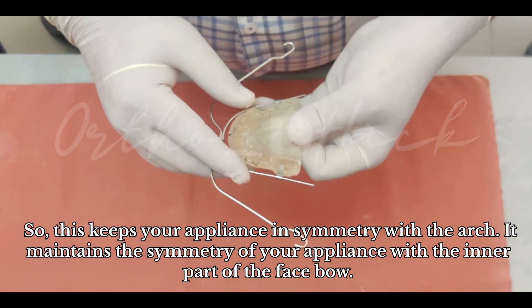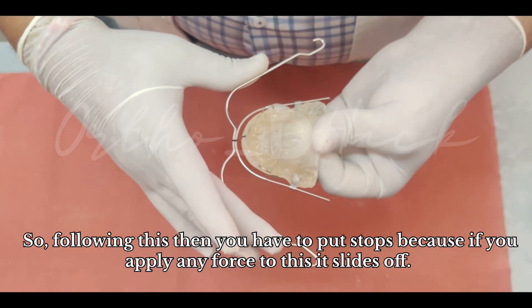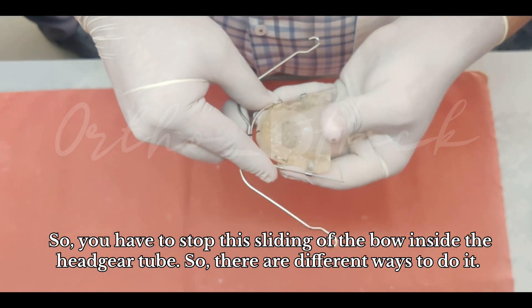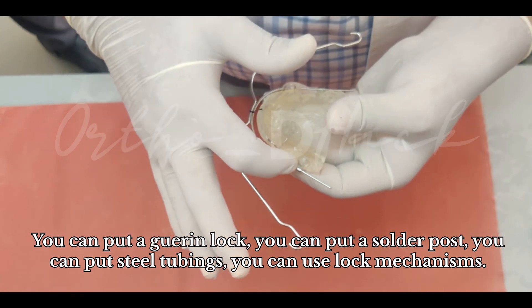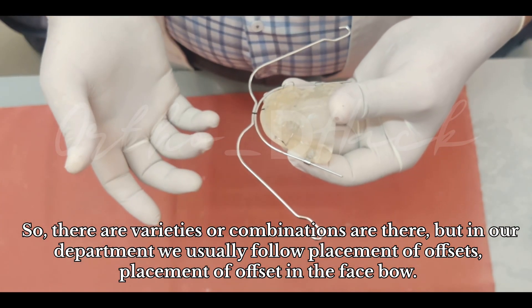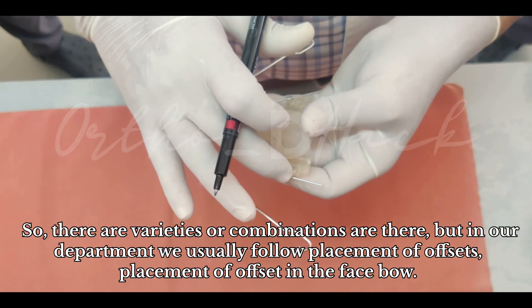This keeps your appliance in symmetry with the arch — it maintains the symmetry of your appliance with the inner part of the face bow. Following this, you have to put stops, because if you apply any force it will slide off. You have to stop this sliding of the bow inside the headgear tube. There are different ways: you can put a Guerin lock, a soldered post, steel tubings, or lock mechanisms.